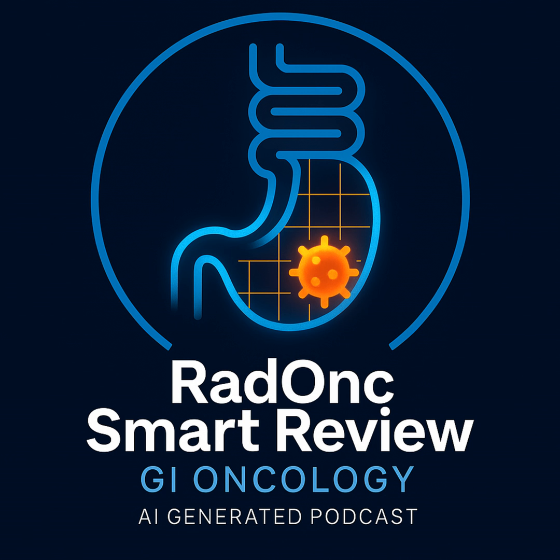And technique-wise for post-APR cases? IMRT is generally preferred in the post-operative setting, especially after an APR. The reason is that after removing the rectum, the small bowel often falls down into the empty pelvic space. Ah, right into the radiation field. Exactly. IMRT gives you the conformality you need to treat the target volumes while carefully sculpting the dose away from those sensitive small bowel loops. Much harder to do well with older 3D conformal techniques in this situation.